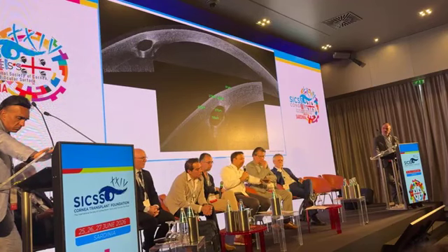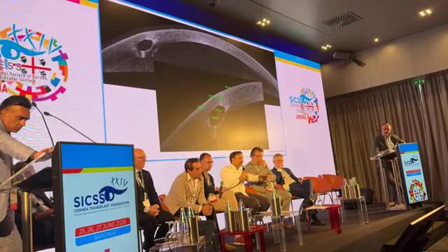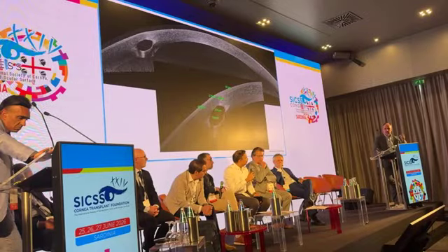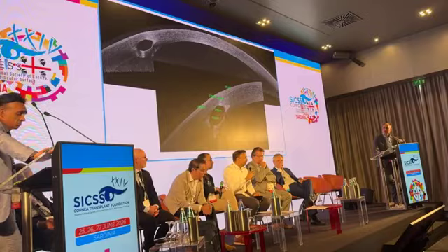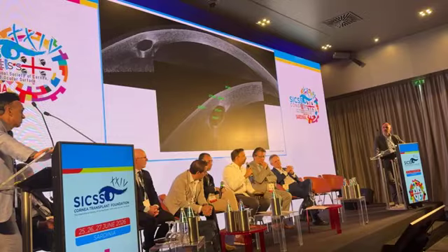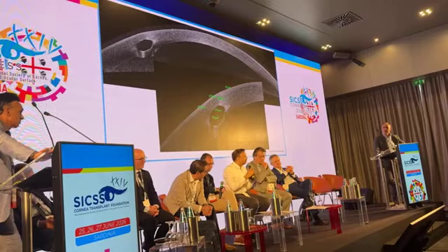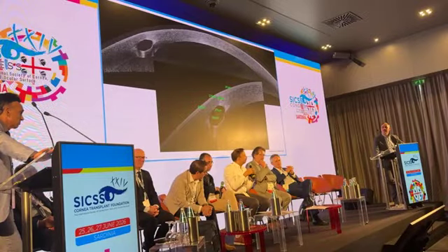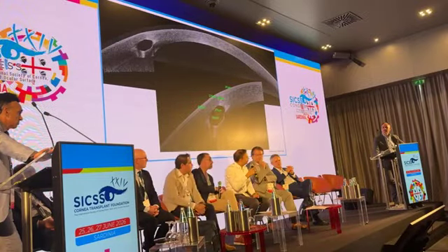You see the segment is at the right depth, you see the epithelial thickening just central to the segment that's been placed. So, do you think that part of the effect that we see with CARES is because we can implant them more superficially? Yeah, but in my personal experience, I started off with 200 microns. Now I'm comfortable putting them at 300, 330 because you see the overlying stroma getting compressed quite a bit, and in the long run, I'm worried about any extrusion.